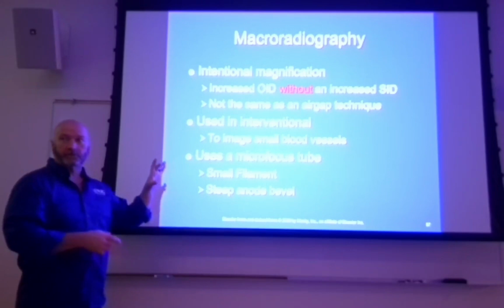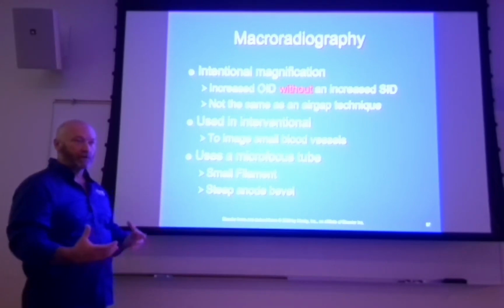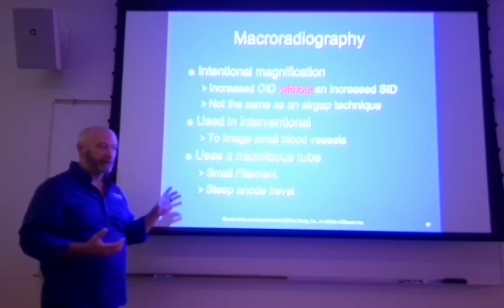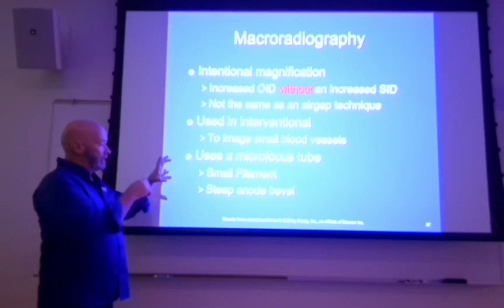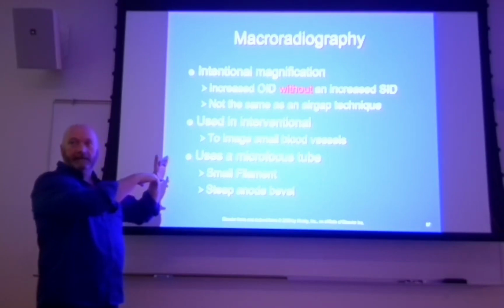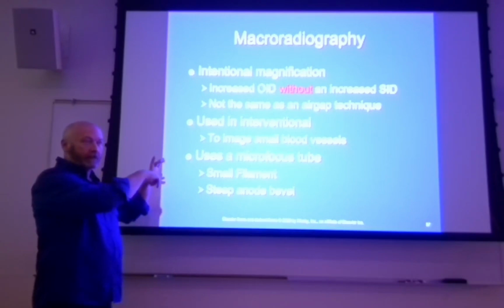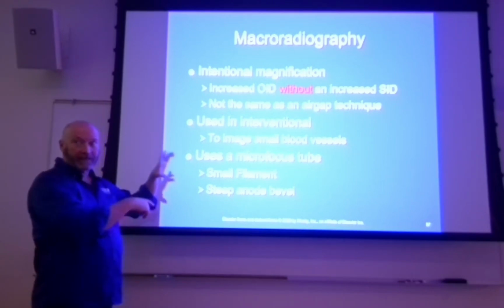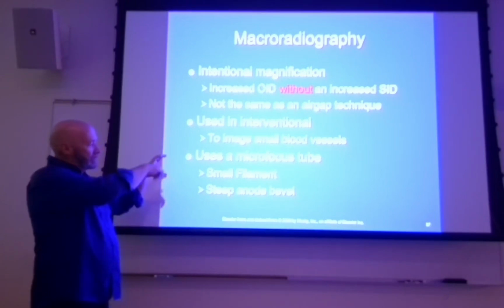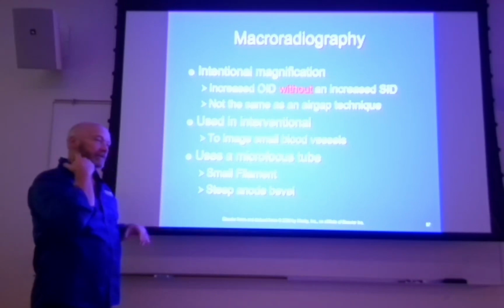Traditionally, the smaller of those two ends is going to be your X-ray tube, and the larger is going to be your image intensifier. So with a C-arm, you can change your OID and your SOD. You can't really change SID, right? It's locked into place. So you can change where the patient is in that, and therefore change your magnification.